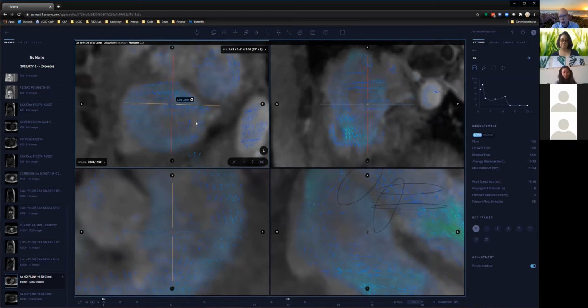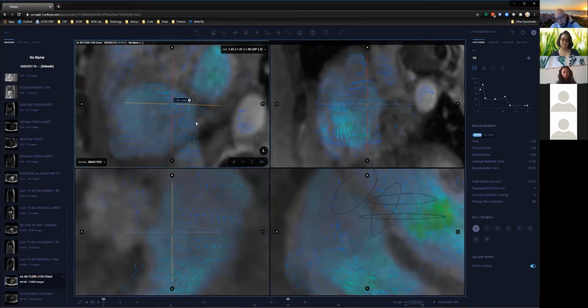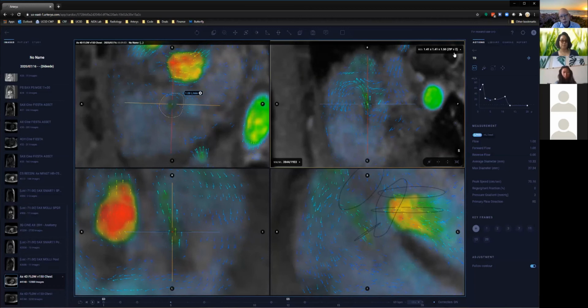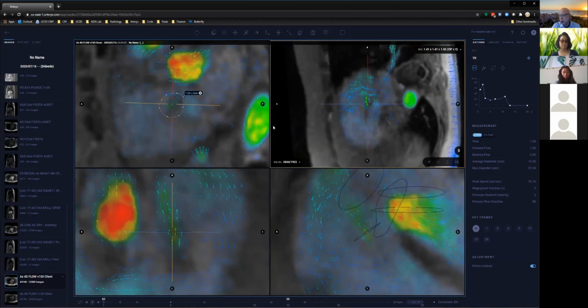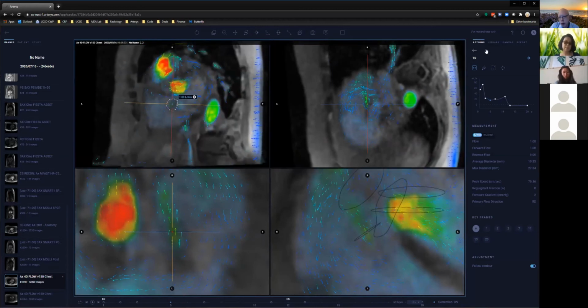Yeah, a lot of people do the indirect approach instead, taking the stroke volume and subtracting off the net flow from the outflow valve as a good strategy. Yeah, I think even that is complicated because you can have error in your stroke volume measurements from your standard anatomic short axis SSFP or whatever.